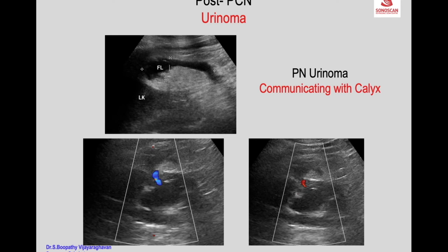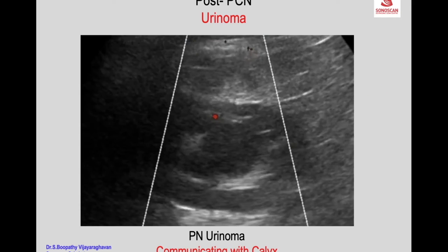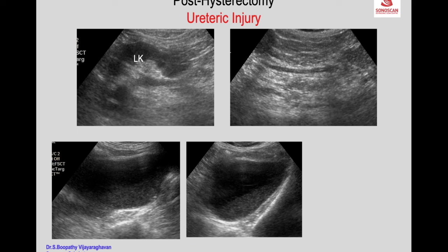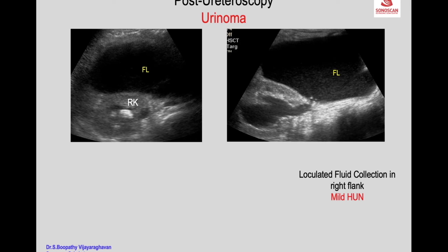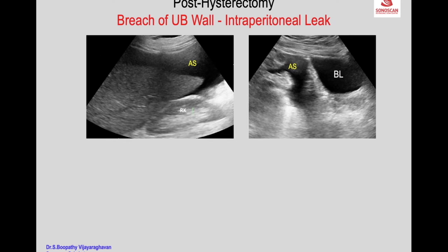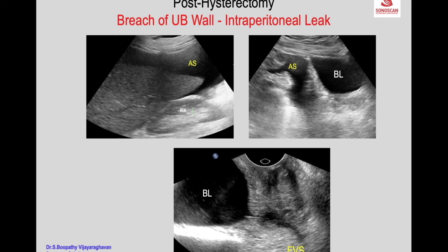We come to the calyx and the urinoma with a press-release technique of the probe, which can be seen on the scan. There is mild hydronephrosis of the left kidney and mild dilatation of the ureter. When you trace the ureter there is a loculated fluid collection anterior to the kidney in the right flank, with the collecting system and ureter dilated up to the collection.